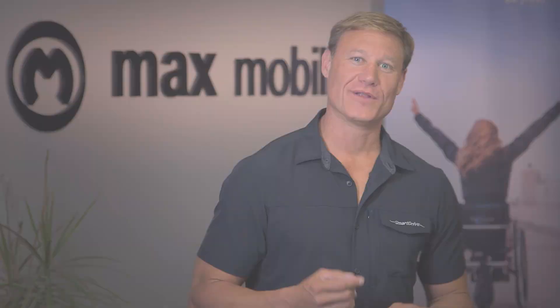Hi, I'm Mark from Max Mobility and today I'm going to show you how to get the most out of your SmartDrive. Let's get rolling.